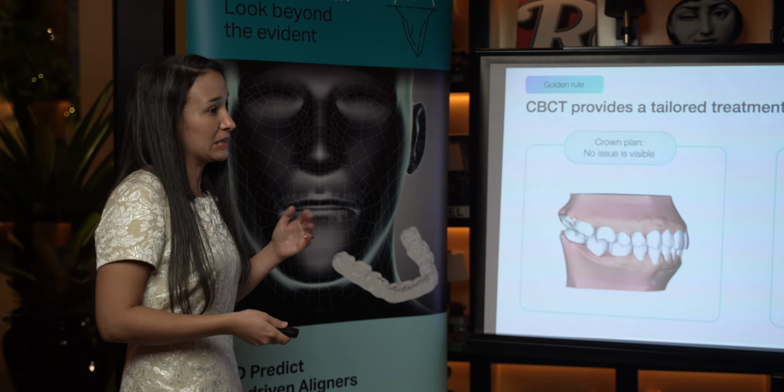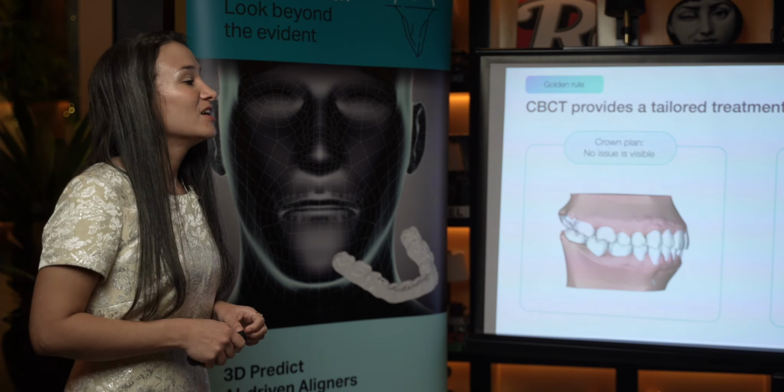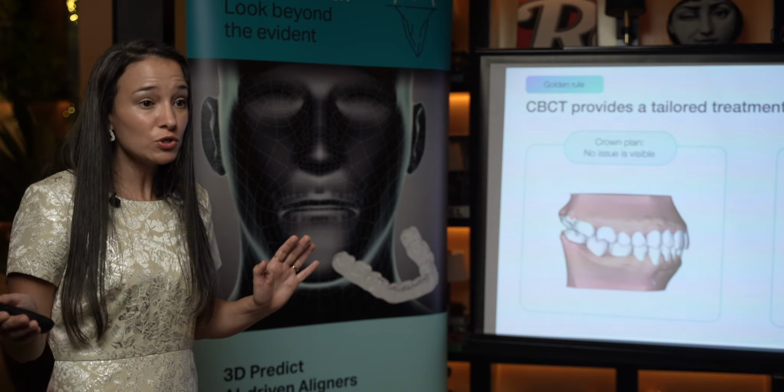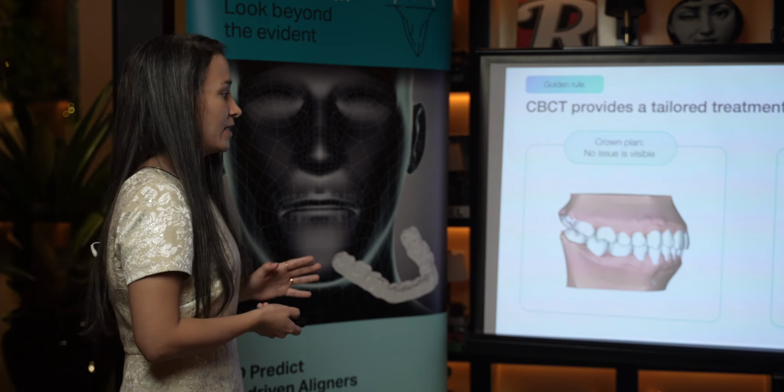But if you submit us a class 3, we are gonna reach back and say, doctor, you should have a CBCT. If you decide not to submit it, it's completely up to you, and we will utilize our database of cases, but it's always best.